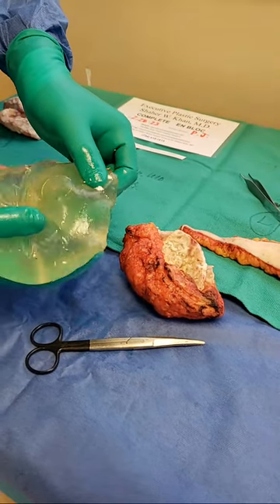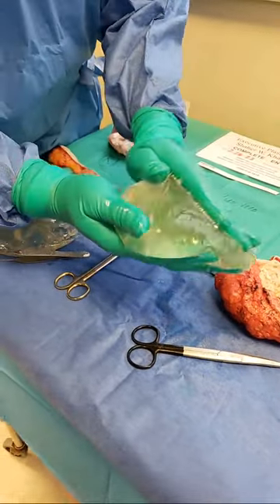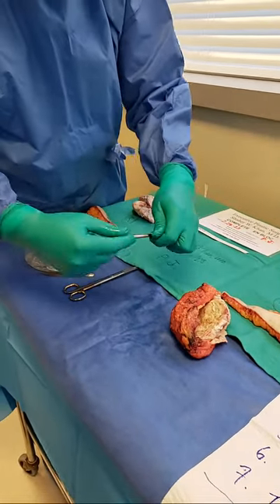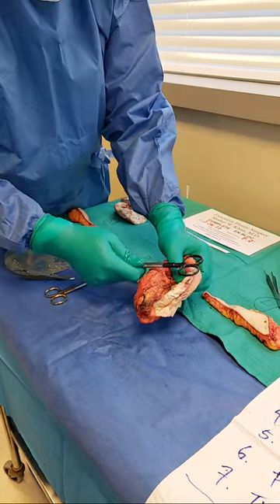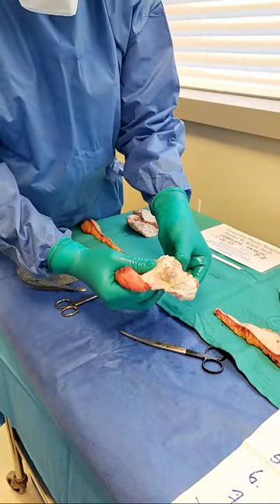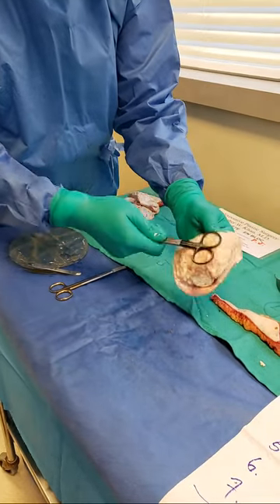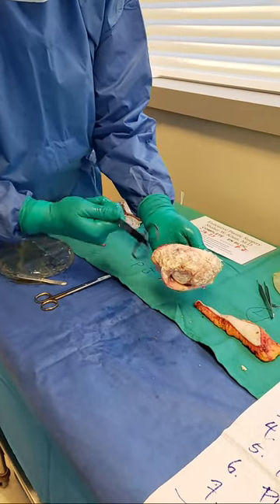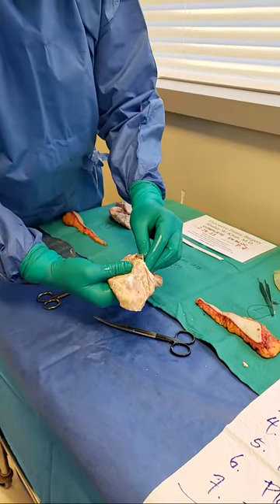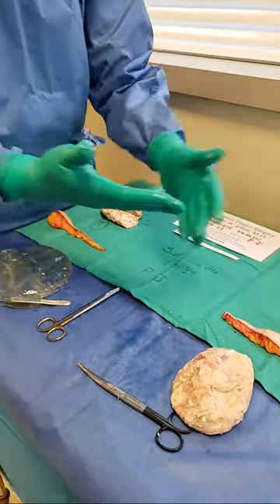It says over here: Silastic, S-I-L-A-S-T-I-C, 400cc. So this is ruptured indeed — all contained. This is how hard it is. You're going to hear the crunchiness. Don't tell me this is safe. I hope the FDA is listening. I'm breaking the shell — this is all hard, angry, inflamed tissue. You can see my finger going through. All contained. This is the whole surgery — it's all en bloc.